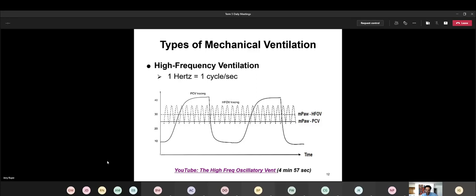The graph here is trying to show the main difference between a regular ventilator and patients in pressure control, which is the graph here, or the tracing here. This is a pressure time graph. And then this is the up and down, up and down, up and down. These are those little tiny breaths that are being generated by the high frequency oscillator. So they place them both on the same picture here just to compare both at the same time. Now with the regular ventilator, baby's in pressure control.